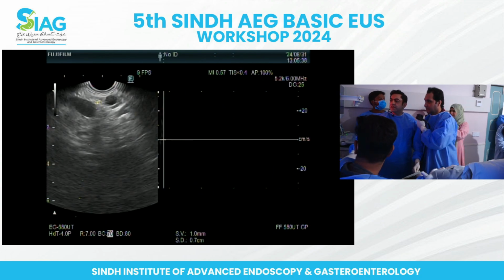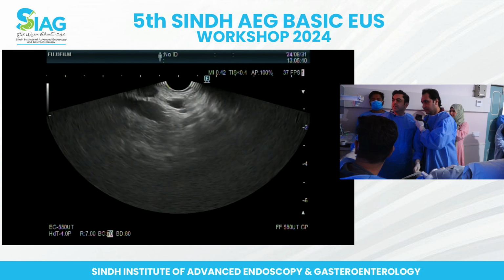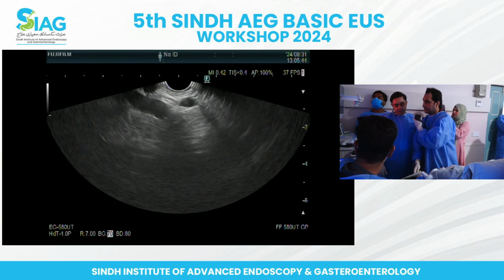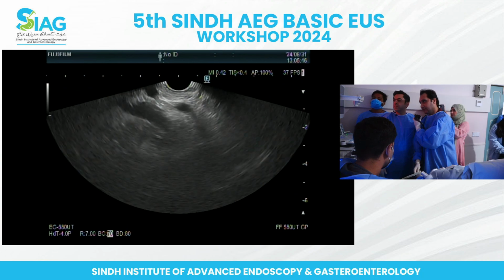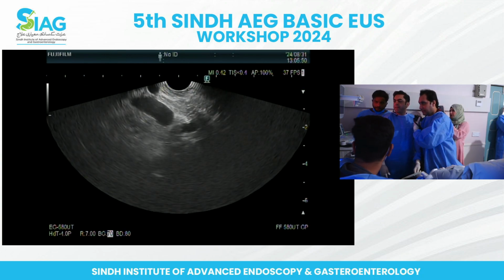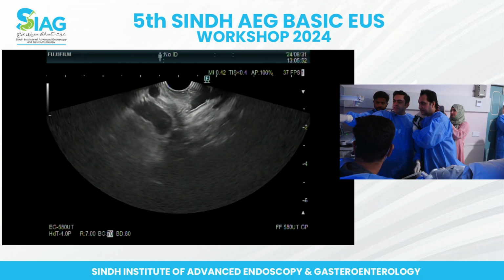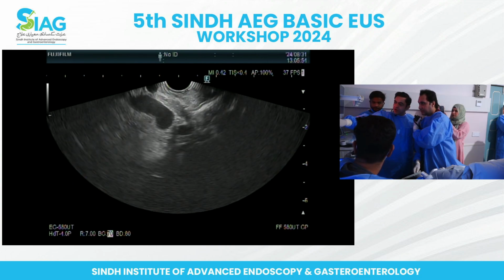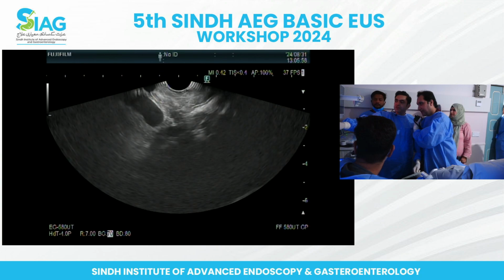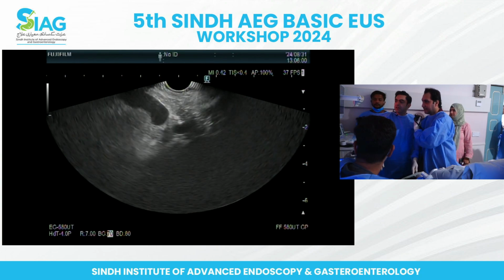Excellent. That's great. Yeah, keep on following that. Yeah, clockwise, keep on twisting. Excellent. So it should be going in the hilum. It's not gone yet completely, but yes, you are on your way. So that's the spleen coming into view now. You can see the spleen. You can see the hilum, yeah.